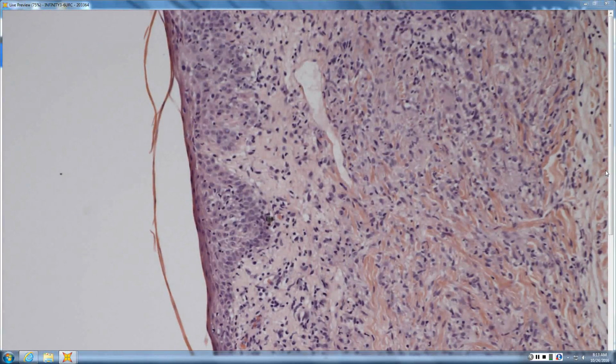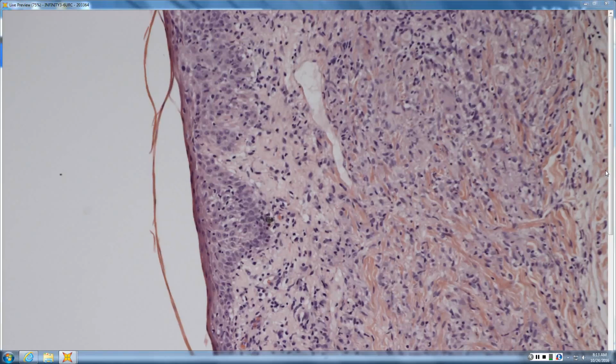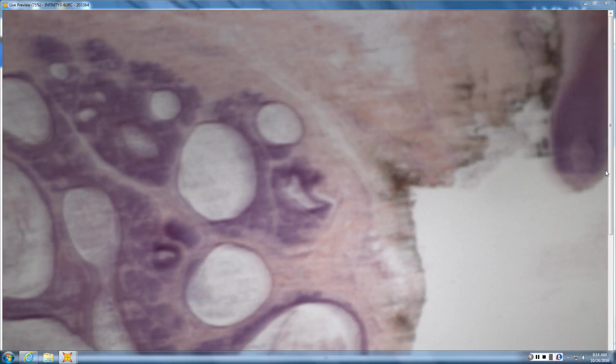Syphilis. Can syphilis produce granulomas? Absolutely. Those are gummas, right? Gummas are granulomatous syphilis. So this is granulomatous syphilis. Often you still have the hint of the busy dermis and the interface dermatitis pointing towards syphilis. Okay.